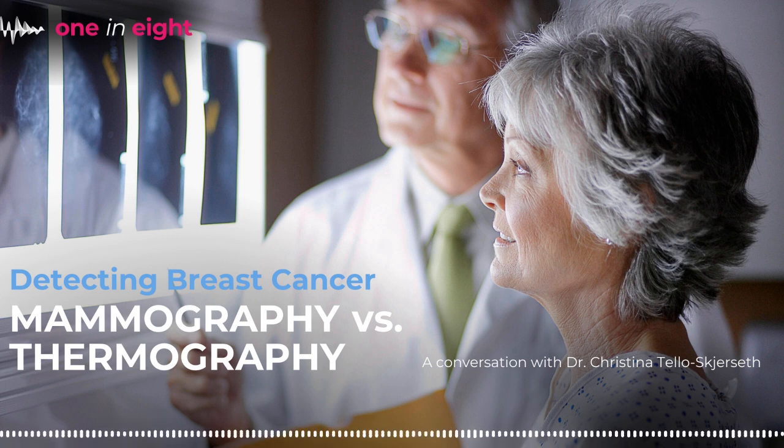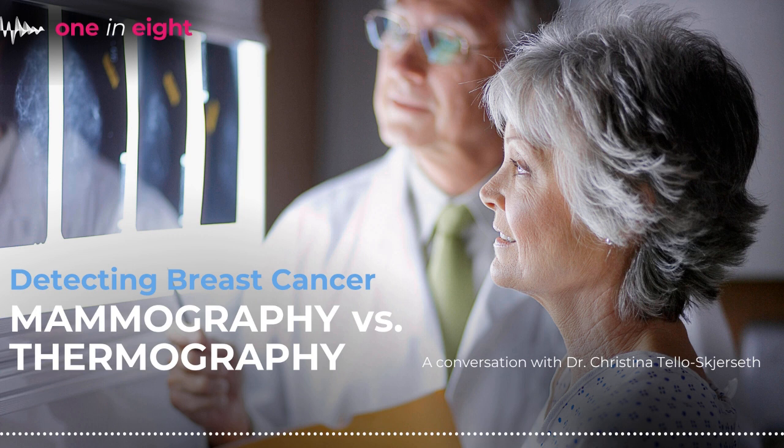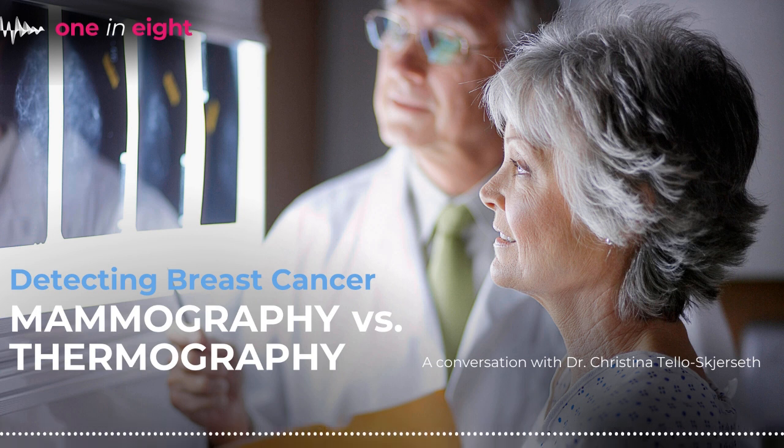So your body is getting radiation from the machine. Most of our data regarding the harms of radiation in general come from atomic bomb survivors in the 40s and other atomic disasters we've had. And it's all extrapolated data showing what the potential risks are for having certain doses of radiation. Now, mammography has a very, very low dose of radiation. It's about equivalent to maybe getting 3 to 5 chest x-rays.